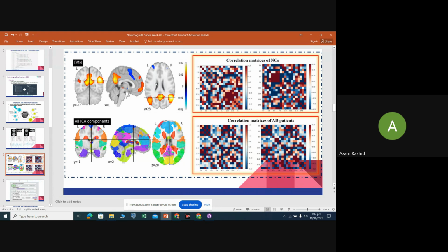Doctors most prefer this view because it gives you a clear analysis of the disease, like the tissues and other things which are clear. And you see that portions which have some symptoms regarding Alzheimer's are also mapped.